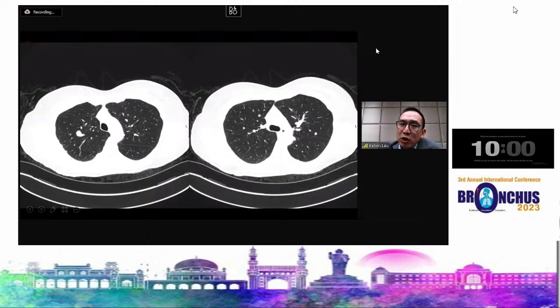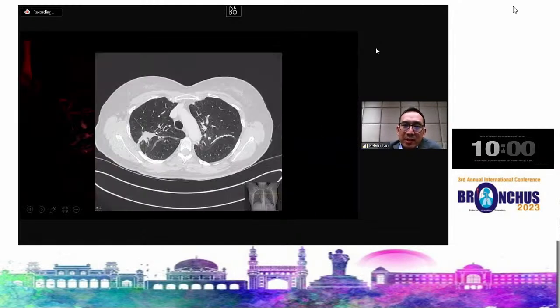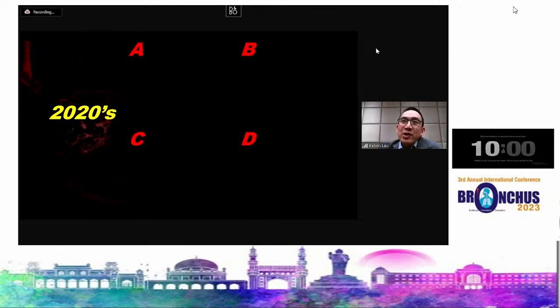So I decided the best thing was to do the bronchoscopic approach here, put a bronchoscope, reach this lesion and ablate it, burn it away, and then turn the patient over and wedge the left-hand side. So this is the ablation on one side and the staple line on the other side 1 month after the procedure. Why am I showing this? Because the bronchial approach is going to be a big competing technique to resection, and there are certain lesions which are particularly suitable for that, driven by a robot.